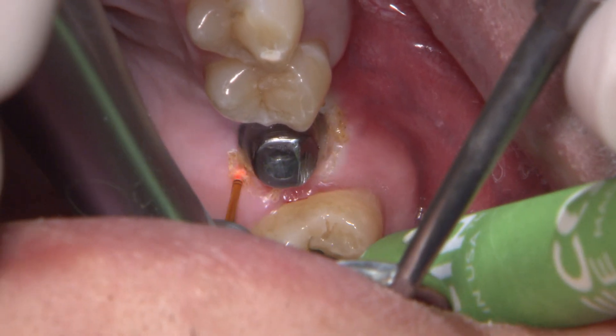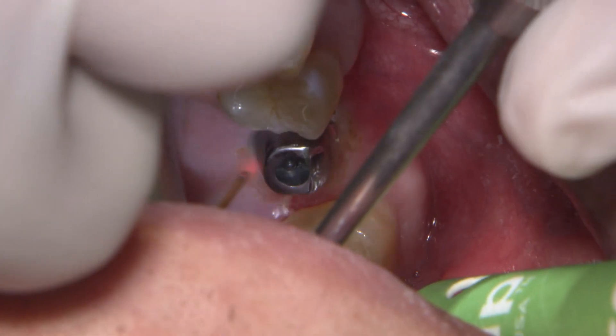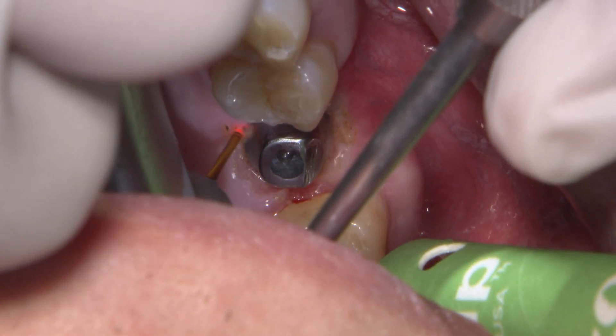For this case, I'm using the BioLase WaterLase YSGG all tissue laser to trough around the abutment, which helps to expose the margins for the scanner.